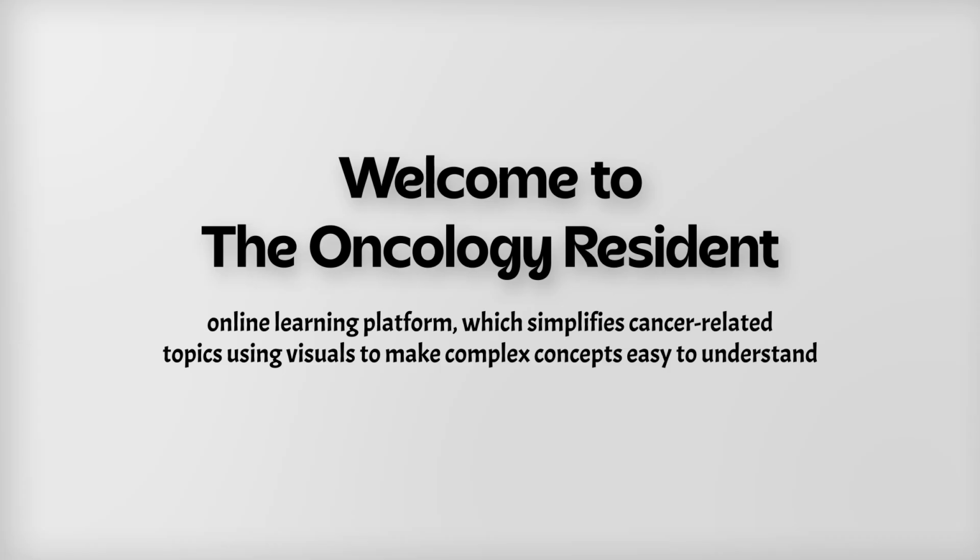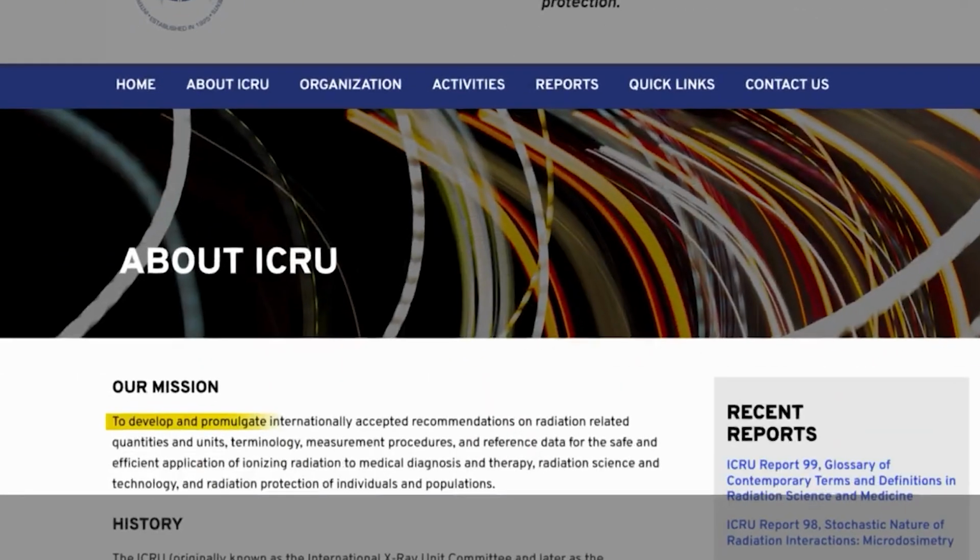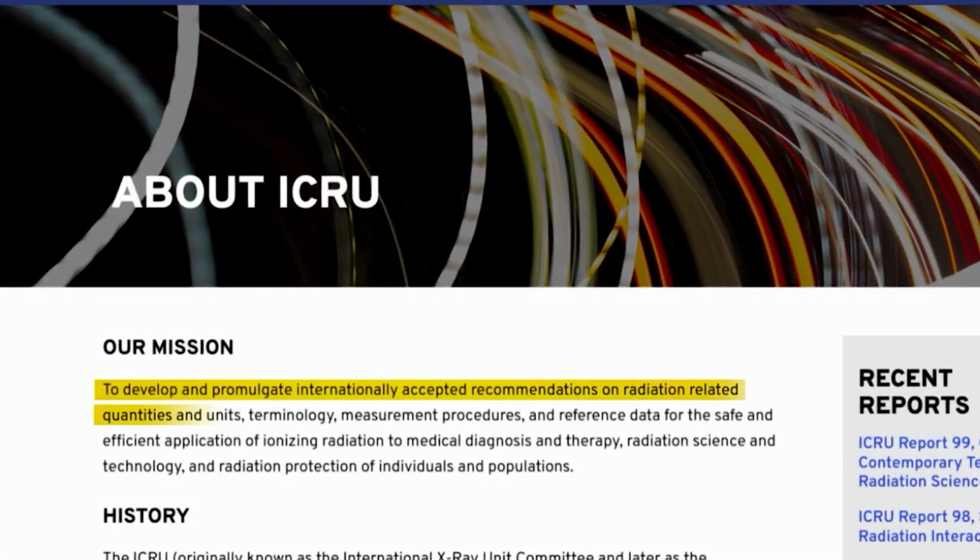We use visual aids to help make key oncology concepts easy to understand. In this video, we will go through the ICRU definitions. It's worth noting that these definitions have evolved over time, most notably through ICRU reports 50, 62, and 83, with report 83 providing updated guidance specifically for IMRT.